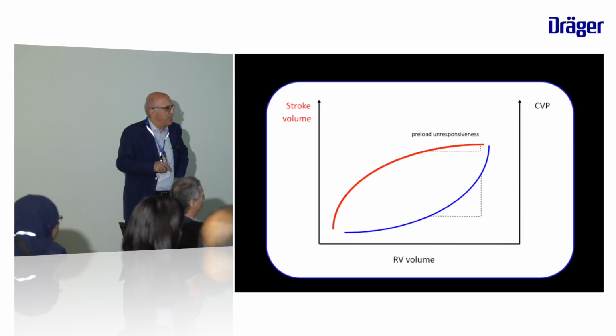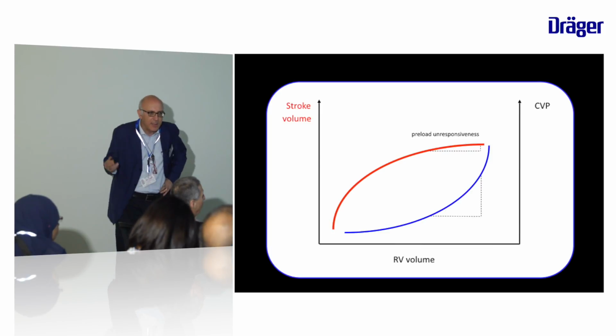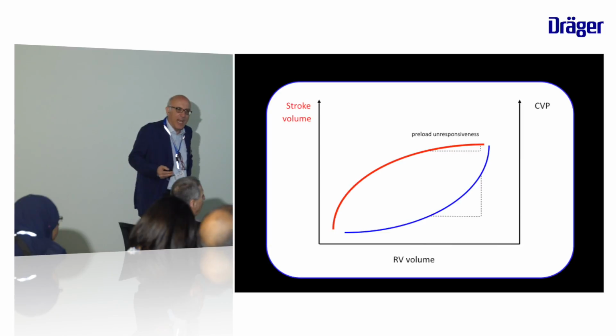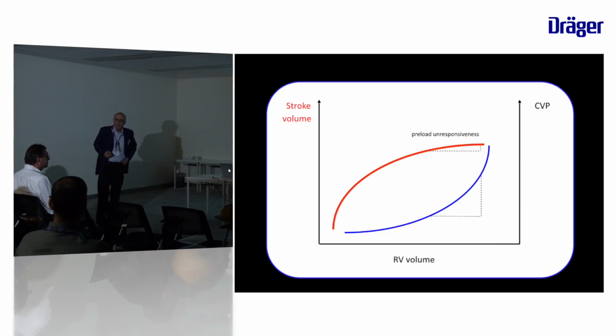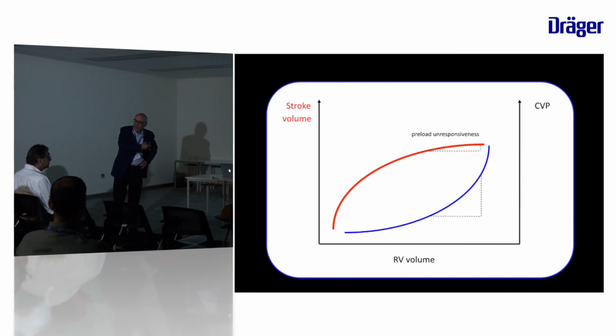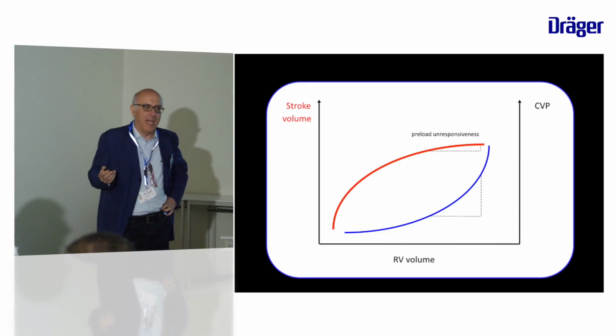However, the change in CVP is quite high. That's why I would not exclude the CVP at all from the guidelines. I think that, Alberto, do you agree? It's a good indicator. In fact, that's my point, no? This is just being a little bit critical on this avoidance of CVP at all.